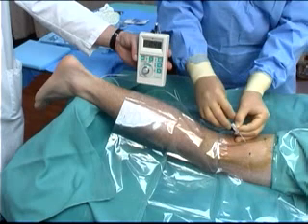The tibial component of the sciatic nerve is indicated by brisk plantar flexion motor response at a nerve stimulator output of 0.3 to 0.5 milliamps. This indicates accurate needle placement, but not necessarily accurate catheter placement. Do not inject any local anesthetic or saline through the needle at this stage. The notion that the space can be opened with normal saline to make catheter advancement easier is not based on scientific fact, but rather on fantasy. Saline injection at this stage only serves to make the tissue edematous and to make further nerve stimulation through the catheter impossible or very difficult.